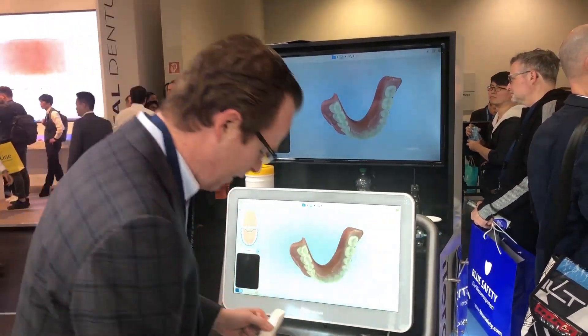All right everybody, this is Dr. Scherer looking at the new iTero Element 5D. Let's go check out some other scanners.